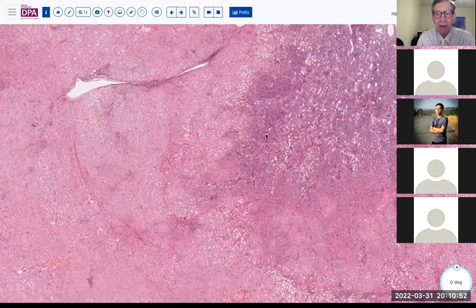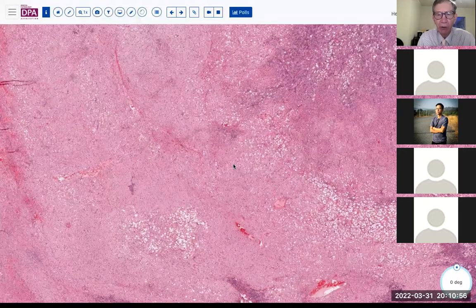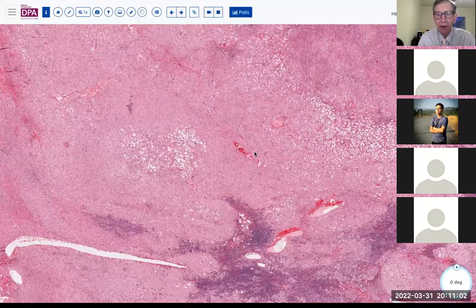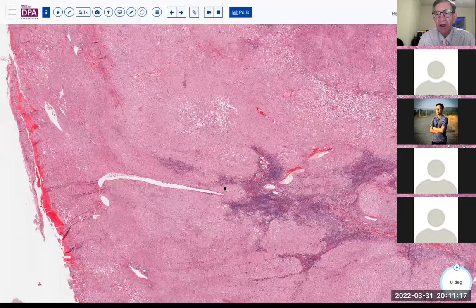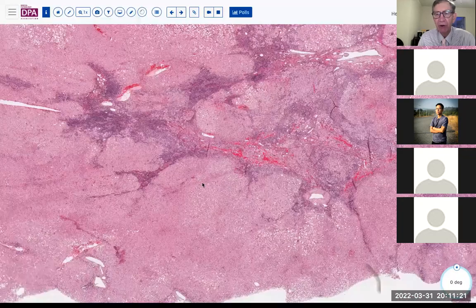Now, I suspect in most of your circumstances that you don't have the immuno or molecular profiling capabilities to subtype these adenomas. And so perhaps aside from maybe beta-catenin staining, which you might have for other purposes, the other markers that are used for subtyping are a little bit beyond the sophistication, I imagine, in most of your institutions.